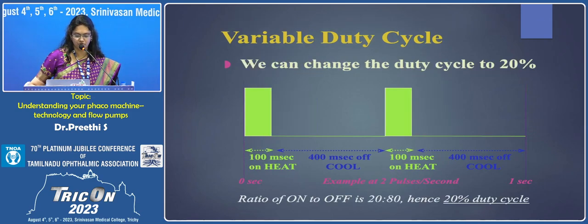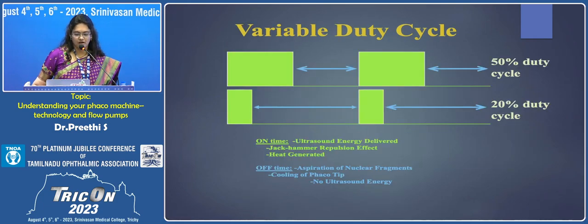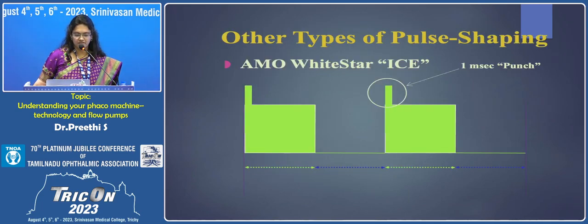You can have a 50% duty cycle, which means half on, half off. We can have a 20% duty cycle, which is 20 on and 80 off. And this is some other type of pulse shaping, which is called punch.